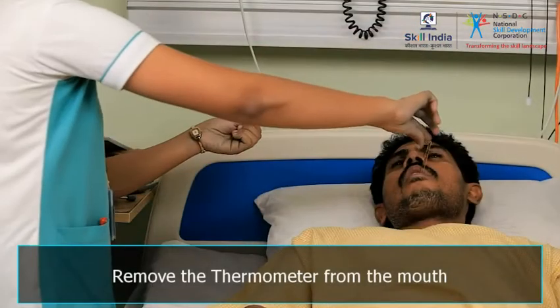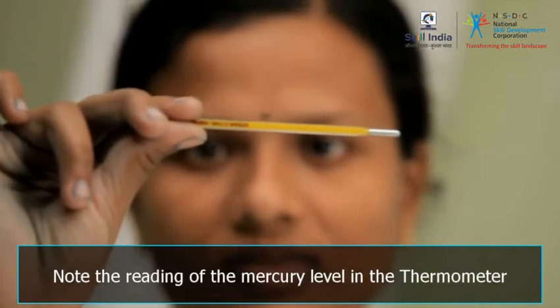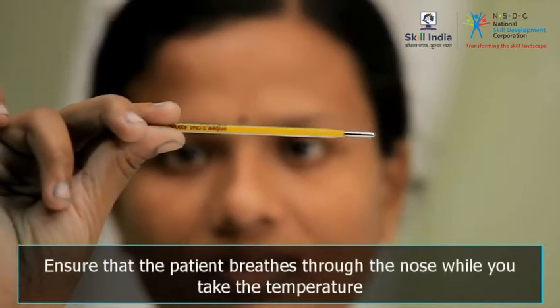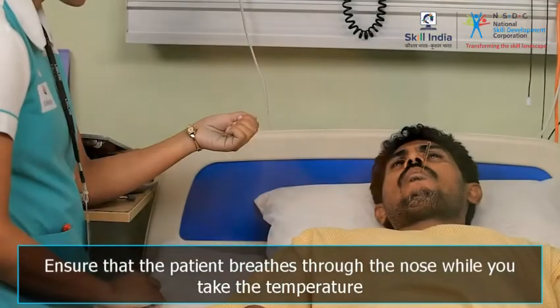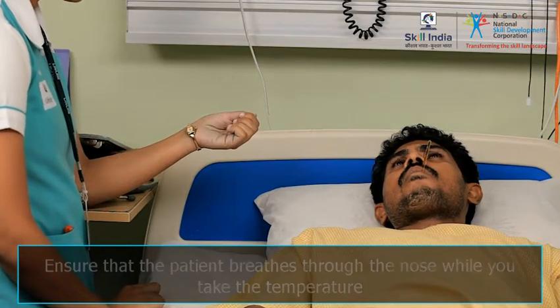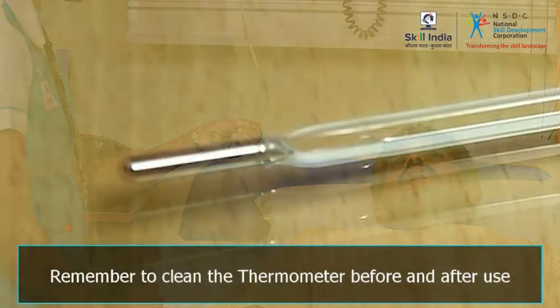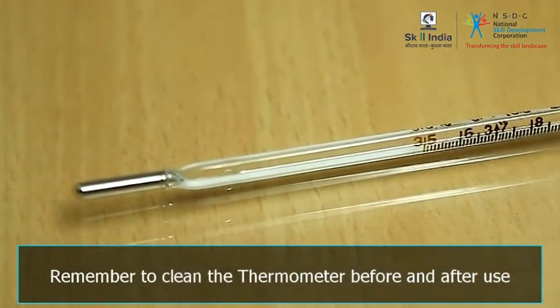Remove the thermometer from the mouth and note the reading. Remember, in order to get an accurate reading, you must ensure that the patient breathes through the nose while you take the temperature. Also remember that thermometers must always be cleaned before and after use.